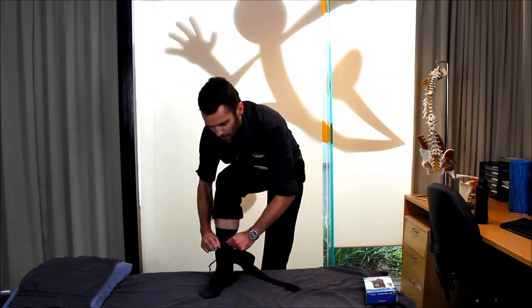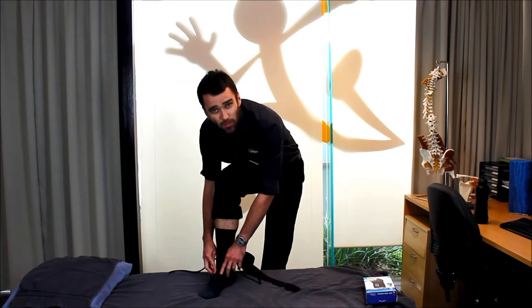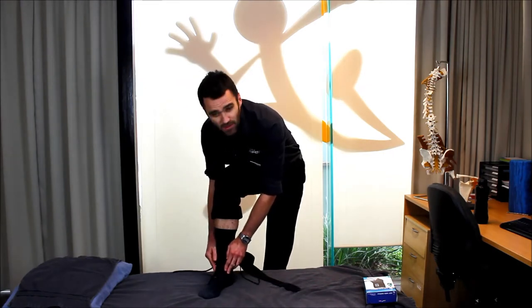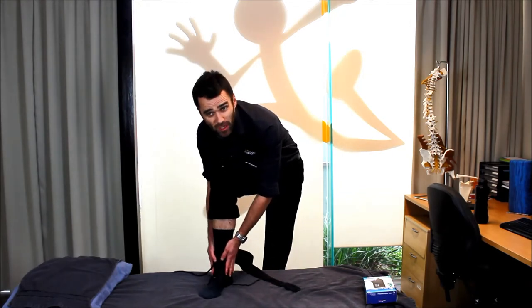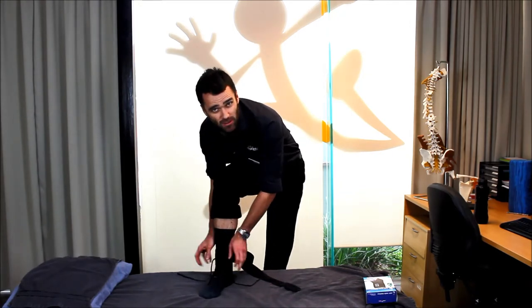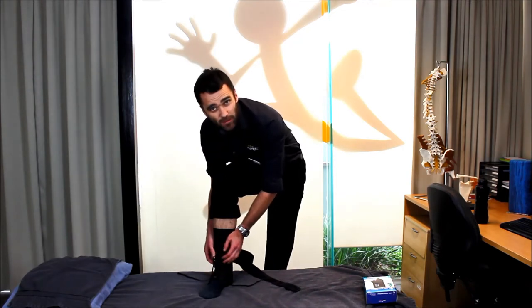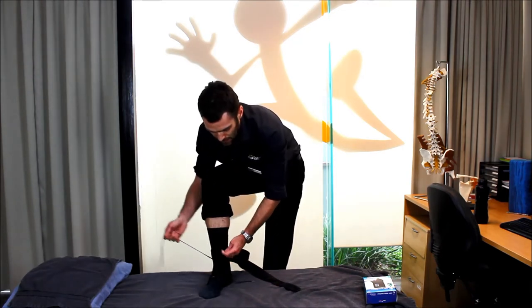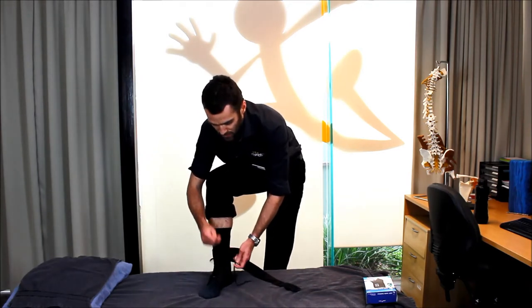Just like a correctly fitting pair of shoes, you want to see that the seams of the brace are coming together to within about two centimeters or so. The brace is certainly too big if those seams are wanting to overlap, and too small if those seams are more than a couple of centimeters apart. You would never ever go and buy a brace without trying it on first to check for fit.